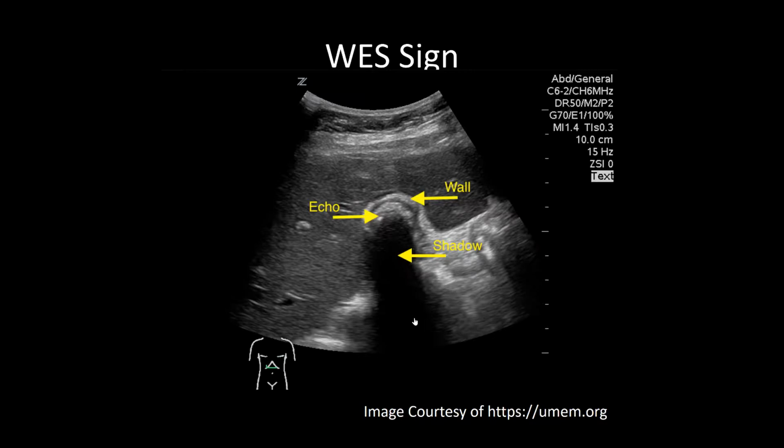WES stands for wall echo shadow. This is when a normally distended gallbladder contracts around a stone and one may not see the anechoic fluid but rather just the wall of the gallbladder, the large hyperechoic stone, and the shadow behind it.